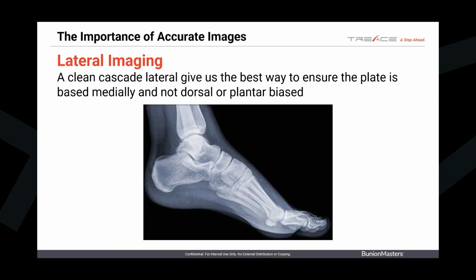You go ahead and pin, take it. You rotate, take it. You translate, take it. You correct the DMA, take it. And right when you fixate everything in position, you take it. Once you know and you've got a hands-free, you don't have to take it for every maneuver after that, but you will because you want to see how the screws are sitting.